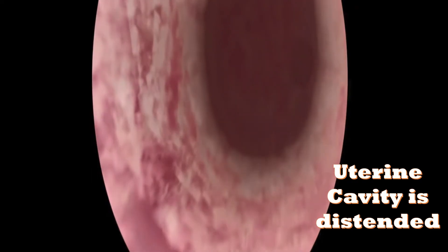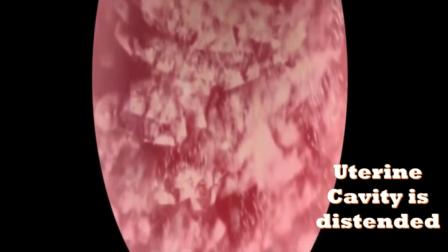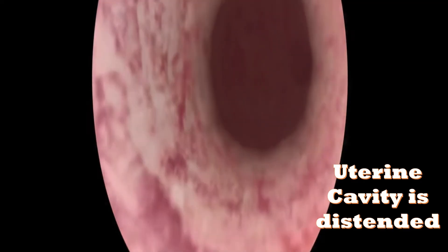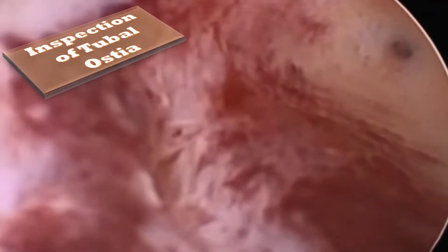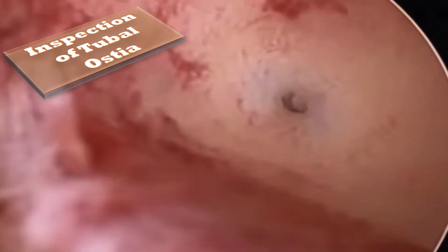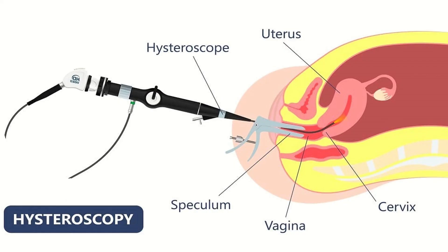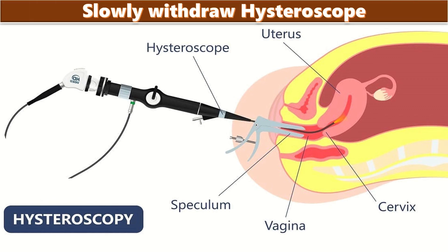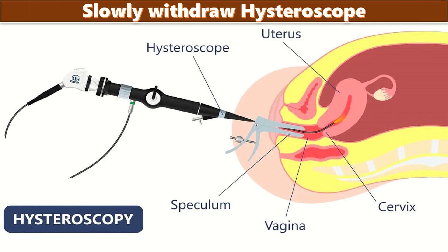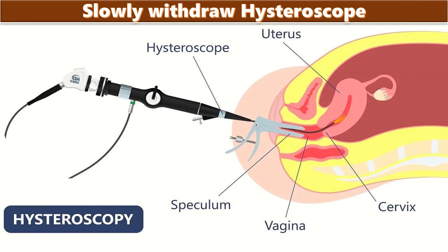The uterine cavity is distended at a flow rate of 40 to 60 ml at a pressure of 40 to 80 mmHg, which is sufficient to achieve good visualization. The hysteroscope is advanced toward the fundus and rotated to allow inspection of the tubal ostia. It is then withdrawn in a slowly rotating fashion to systematically inspect the entire uterine cavity, then removed and the patient repositioned. Detailed notes are written and signed.